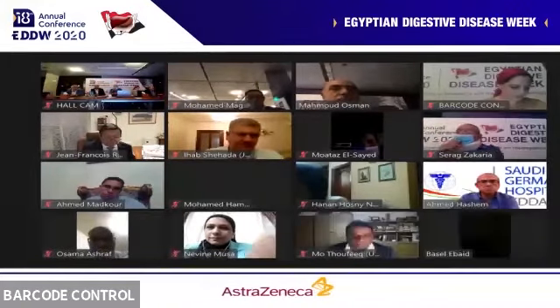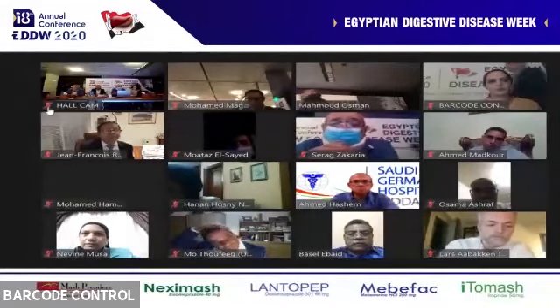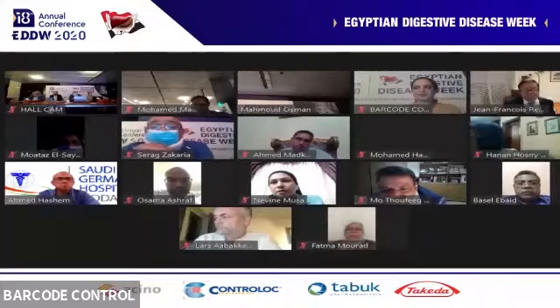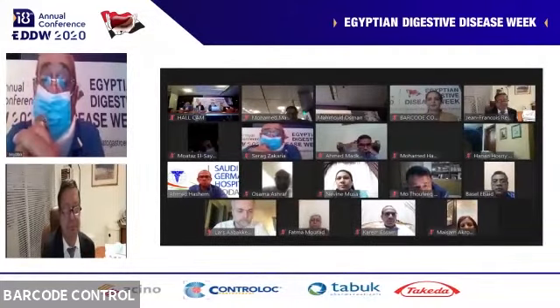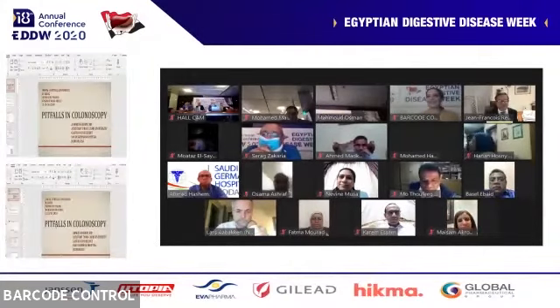Until Dr. Basil is ready, what's your opinion, Jean-Francois, on the sequence until now? The upper GI bleeding, the normal upper GI, the third space management and endoscopy, etc. Being the first man of endoscopy in the world, what's your opinion? No, I'm not laughing. So we move on.